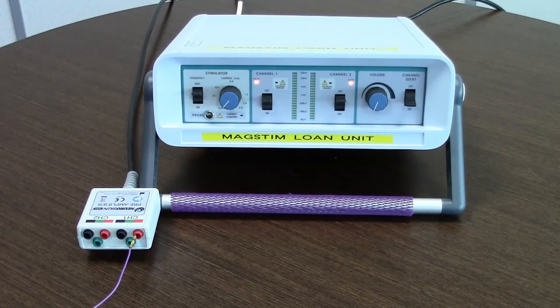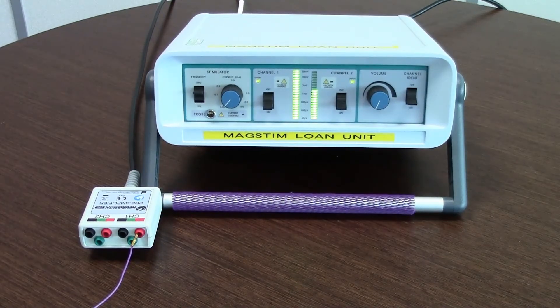To ensure that the pre-amplifier pod is working, place a piece of wire into the red input of channel 1 on the pre-amplifier pod. Following this, switch the nerve monitor to two channels on. If the pre-amplifier pod is working correctly, all segments of the bar graph on channel 1 will light up. Repeat this test for channel 1 black and channel 2 red and black. The green ports do not need to be tested.